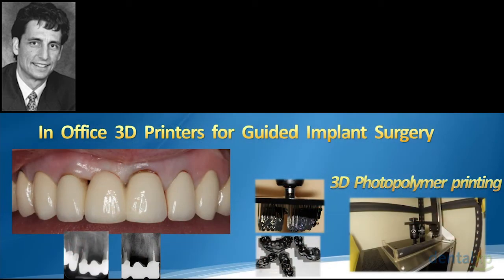So, in-office 3D printers for guided implant surgery. This has been something we've been working on in our office the last 2 years. Dr. Thomas Ashragi, my business partner, has been real instrumental in this. He's very much into the technology side of things. So we have 2 different 3D printers in our office. This is our newest one. It's a photopolymer printer. And we also have a MakerBot that utilizes the heat extrusion mechanism. This gives a little better, higher resolution.